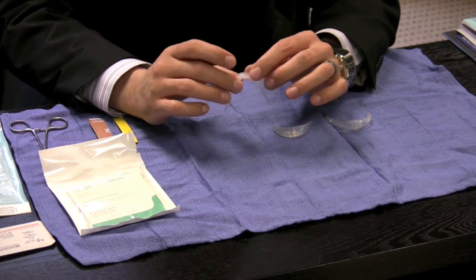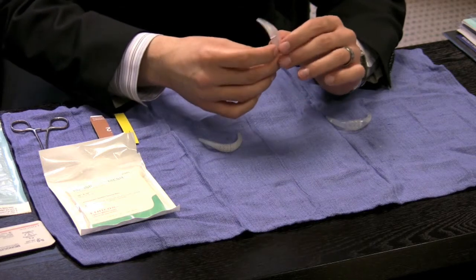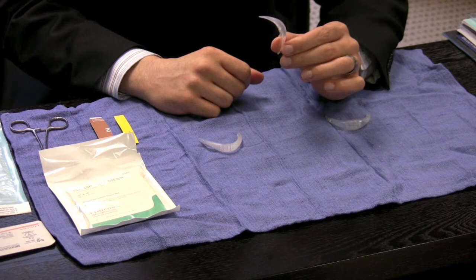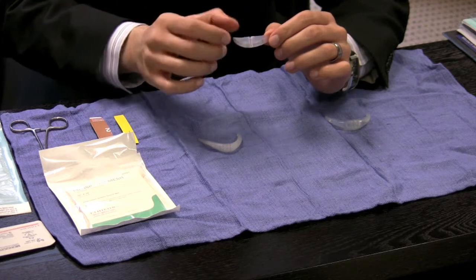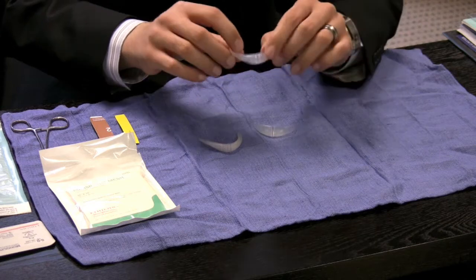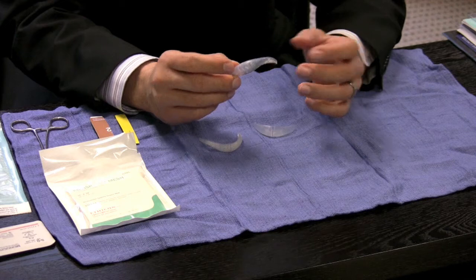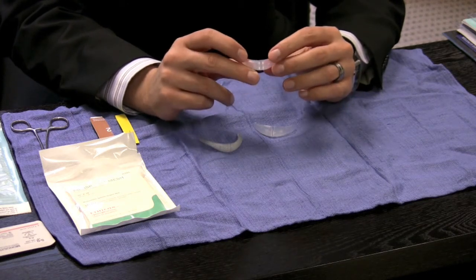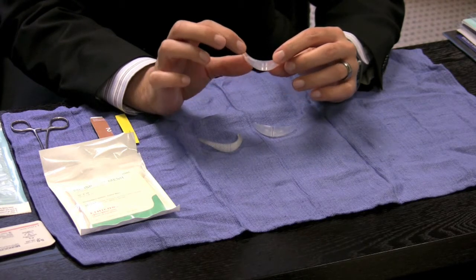You can even trim them to a certain amount, and the different dimensions that are important are the thickness, basically how much augmentation is needed in the anterior posterior dimension, the width in this dimension, or the height of the chin implant, as well as the width in this dimension, or basically from side to side. And you can see that again there's different forms and shapes and sizes. Now the advantage of these is that they're pre-made, and it's very simple to obtain these and pop them into place. The disadvantage is that they can shift, they can move, and you can actually feel the edges of them.